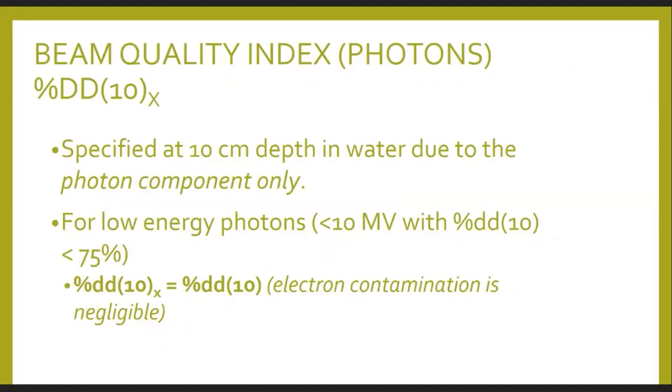These protocols provide a methodology to get the beam quality correction factor. That methodology is based on the beam quality index, which for the case of photons is the percent depth dose at 10 cm for the photon component only.